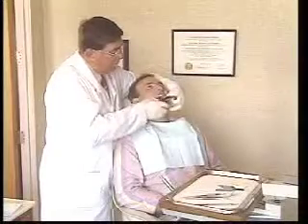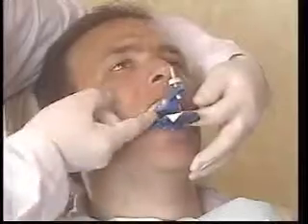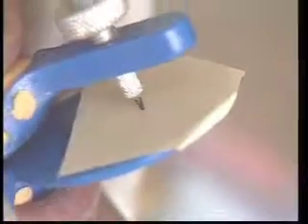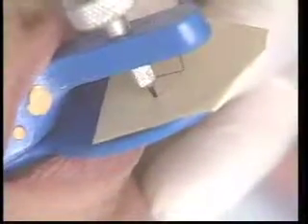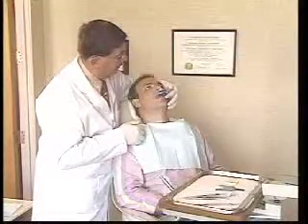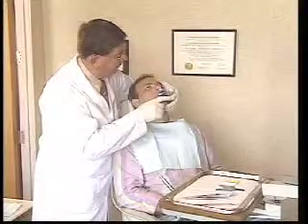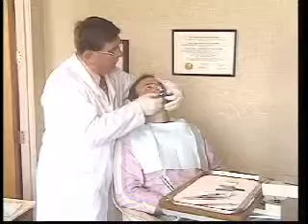When the clutches are in position, they will be in contact in the posterior, but in front they should not contact so as not to move or interfere with the post-it note. Forward, back, forward, back. From there go right, back to the center, to the left, back to the center, up to the left, back to the center, as far back as you can go, up to the left now. That's it, you're done. Perfect.